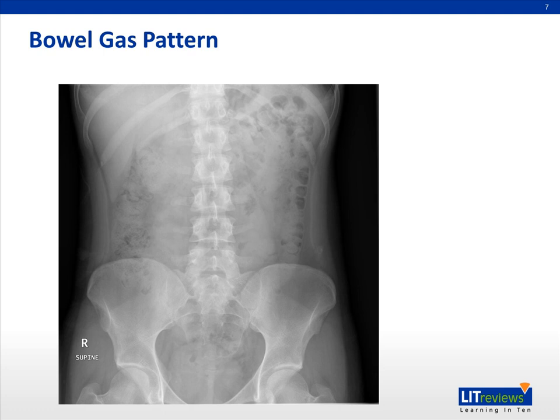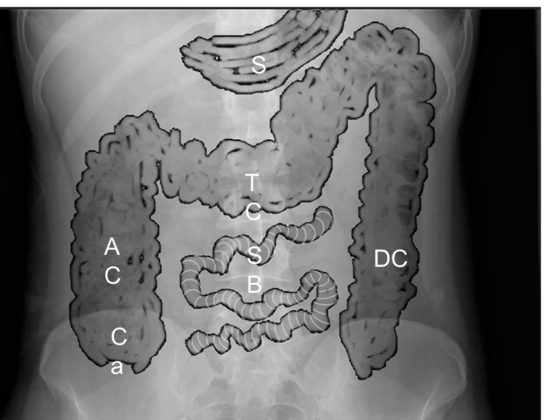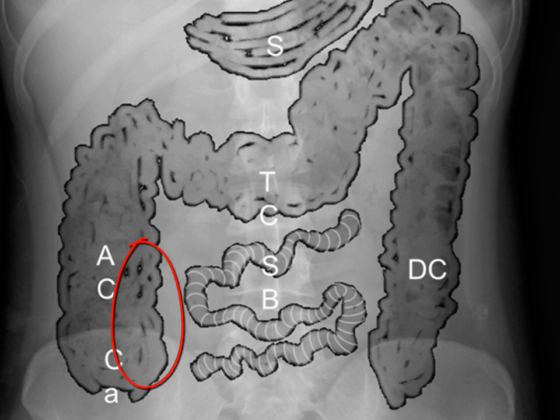For bowel gas patterns, small bowel will be in the central abdomen. They have these thin mucosal folds called plicae circulares, and they are quite tightly spaced together and span across the entire width of the bowel. In the periphery, we will have the large bowel, and they have these haustrations which do not span across the entire width of the bowel, and so can help you distinguish between large and small bowel.